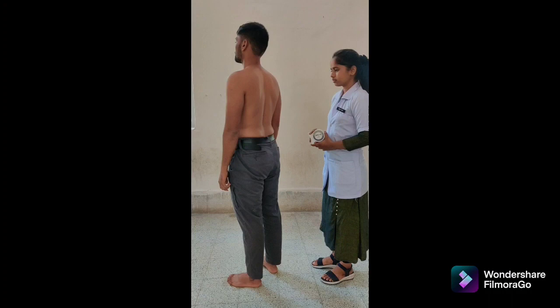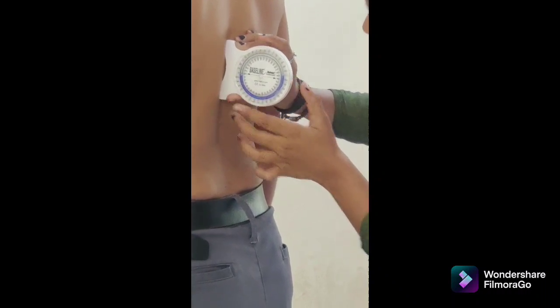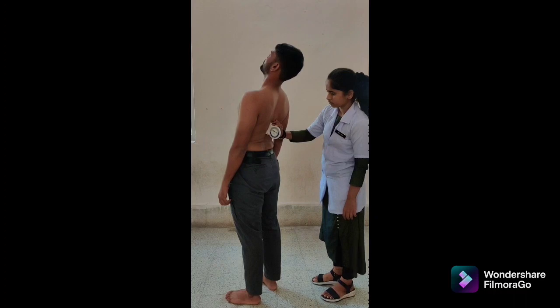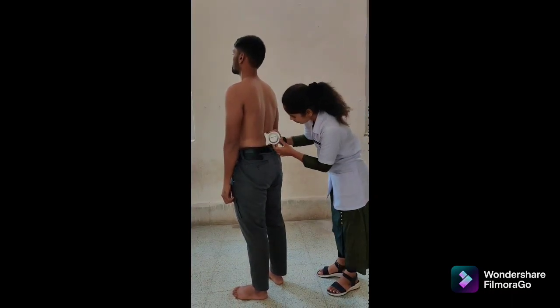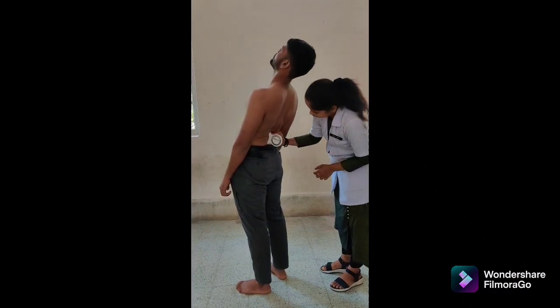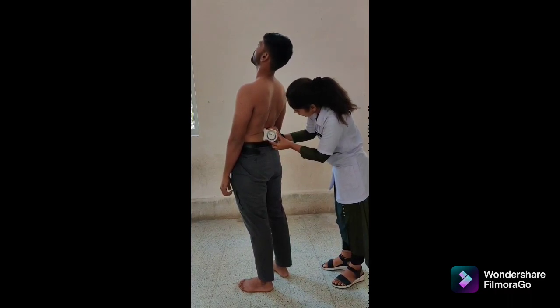Third method for lumbar extension is single inclinometer. Patient position: standing. Place single inclinometer over T12, adjusted to 0 degrees. Instruction: bend backward as far as possible. Maintain the inclinometer at T12 throughout the motion and record the degrees indicated by inclinometer at T12 at the end of motion. Then place the inclinometer over S2. Instruction: bend backward again. Maintain the inclinometer on S2 throughout and take another measurement at S2. The difference between both measurements at T12 and S2 is the lumbar extension range of motion.